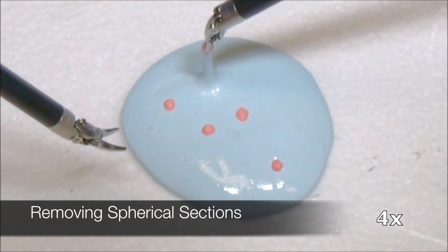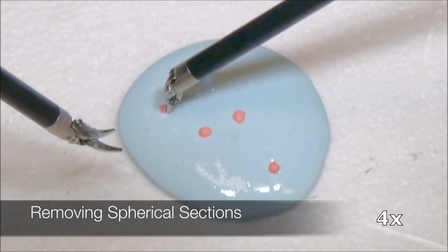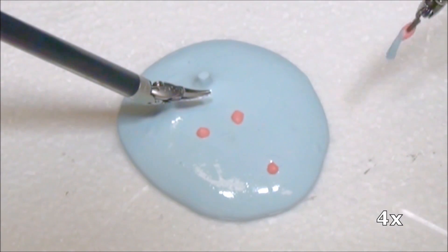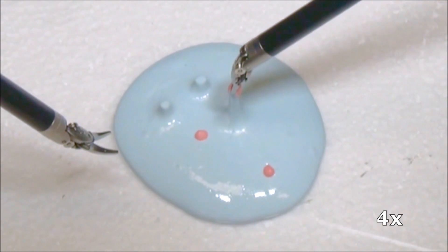The next subtask is spherical debridement, removing a set of randomly placed spherical sections of cancerous tissue. We use plastic putty as a proxy for healthy tissue. Embedded in the healthy tissue are multiple targets made of a viscoelastic material shown in pink.